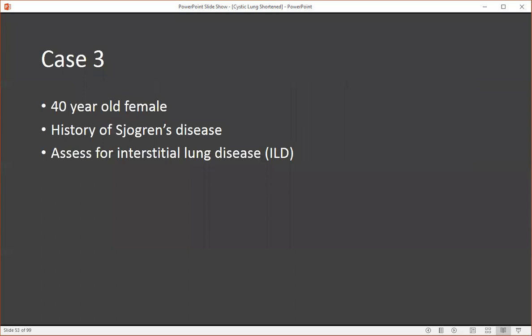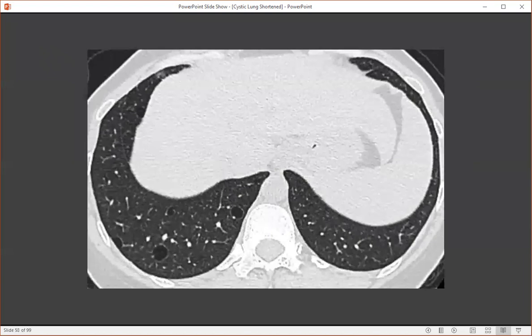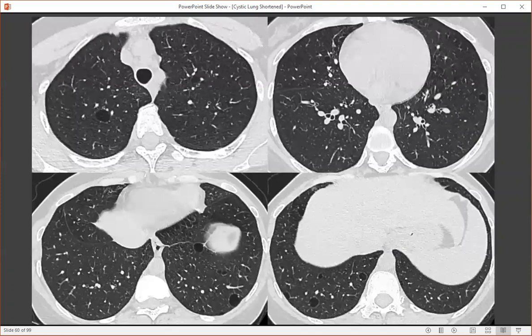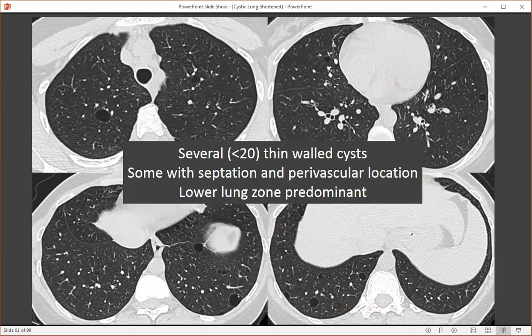Here's case three — a 40-year-old female with a history of Sjögren's disease. We were asked to assess for interstitial lung disease. On CT, we can see several cysts; however, different from the previous two cases, these cysts are predominantly located in the lower lung zones. Looking at these cysts, several have a small vessel running through the wall, so these cysts are described as being perivascular. Some also demonstrated thin septations. In summary, we have an oligocystic lung disease with several thin-walled cysts, some with septation, in a perivascular location that are lower lung zone predominant. In the setting of Sjögren's disease, these findings are highly characteristic of lymphocytic interstitial pneumonia.